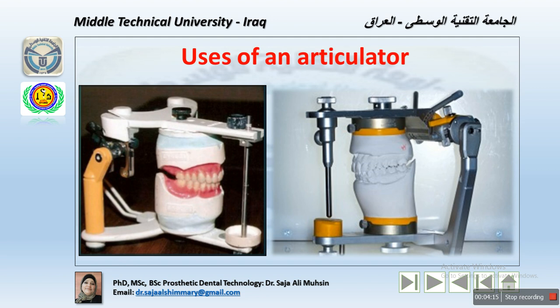Also, the main and most commonly used function of the articulator is to arrange the artificial teeth. All these uses are important to be done with a device like the articulator.